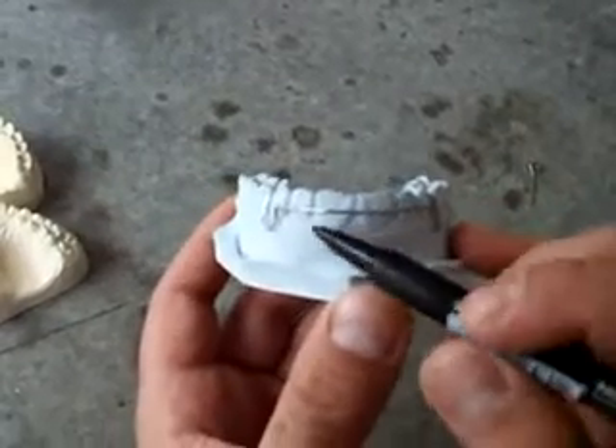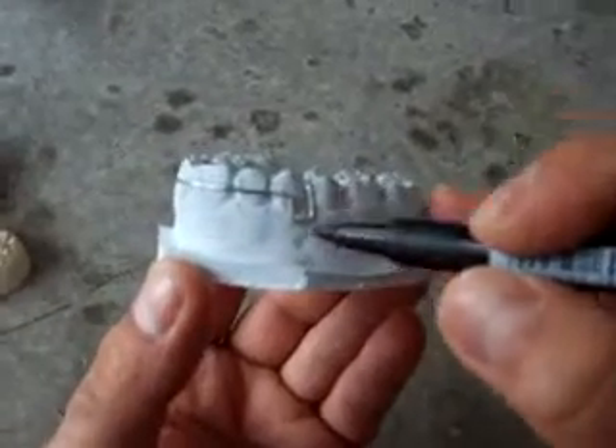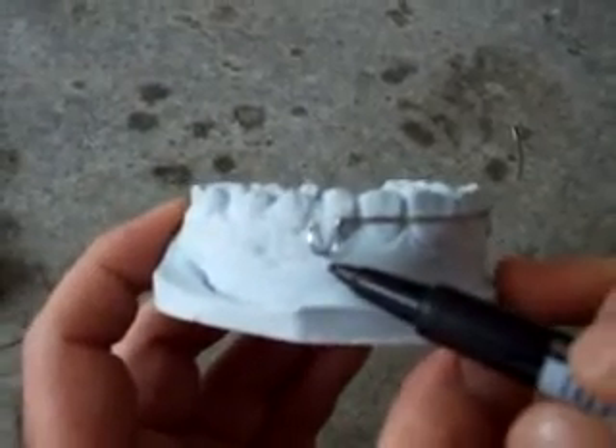Check that the position of the labial bow is parallel labially to the teeth. The loop should be away from the soft tissue by just half a millimeter or one millimeter.